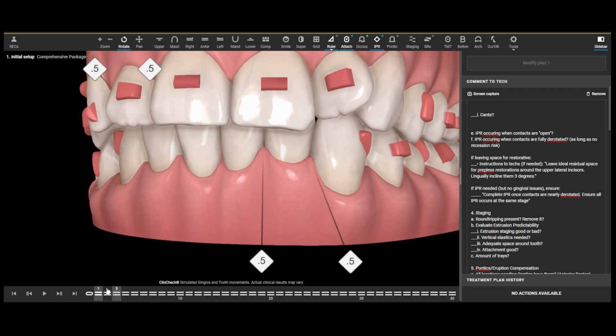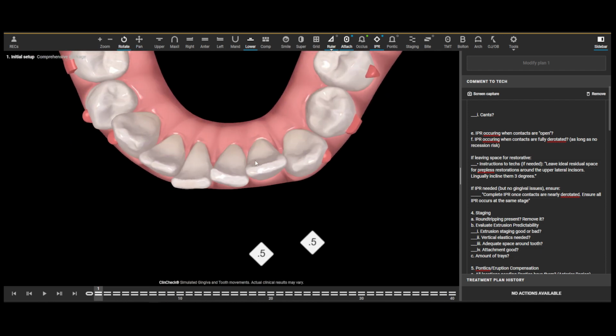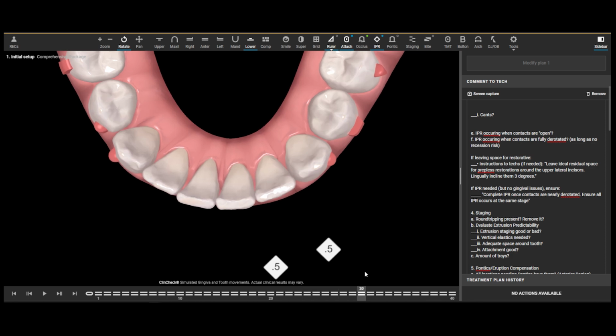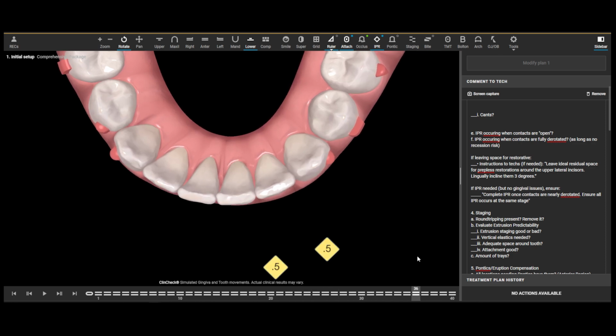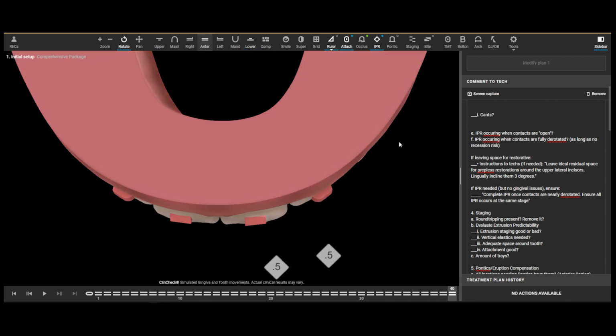Same thing on the lower. Let's check it out. Are the contacts derotating first before the IPR occurs? Everything derotates, derotates, derotates. Again, they kind of wait a bit long and then they do it, which is fine. And then it's finished. Sweet.